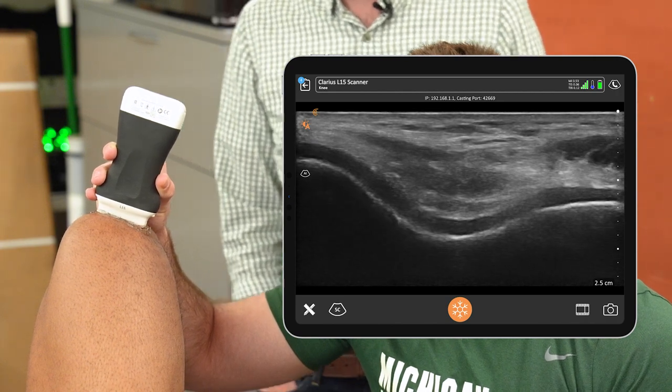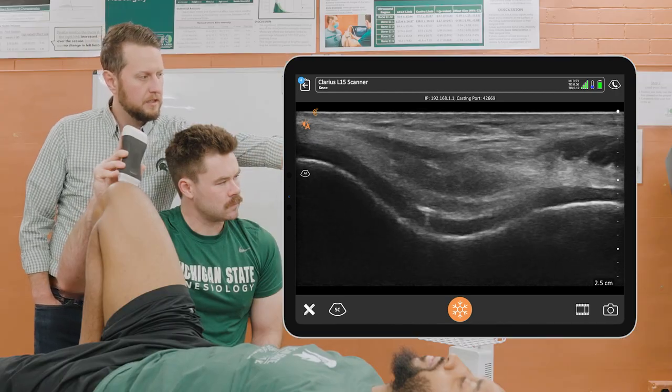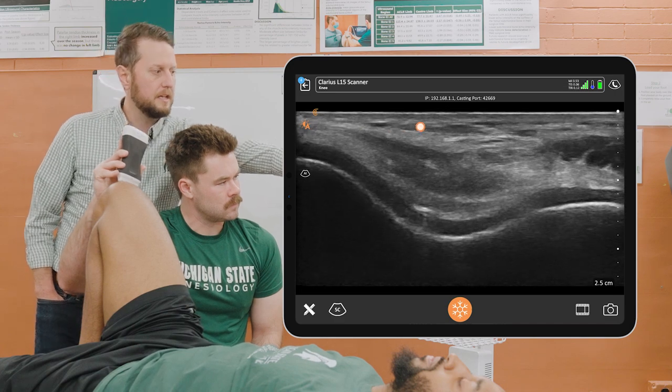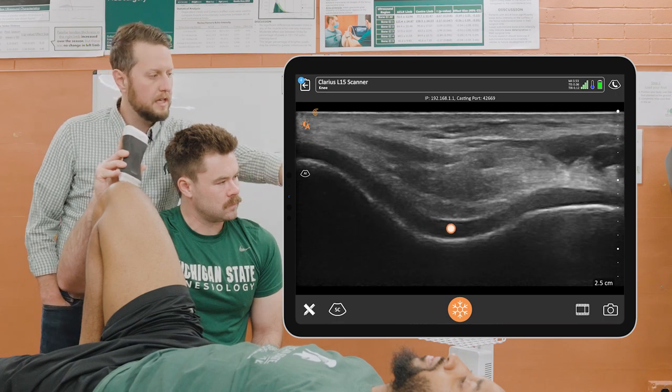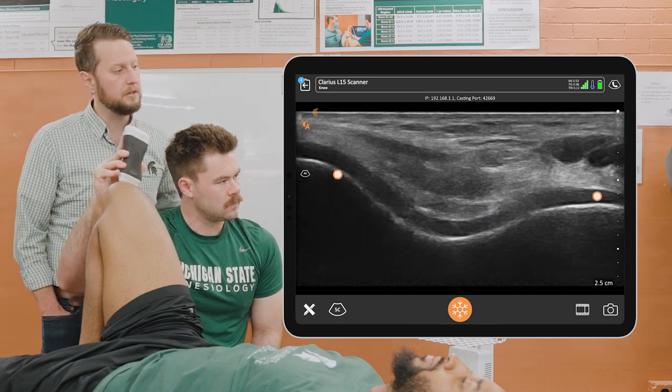What you can see in this picture is our skin and overlying fat, our quadriceps tendon, our articular cartilage that we're focused on, and then the black of the femur down at the bottom there.